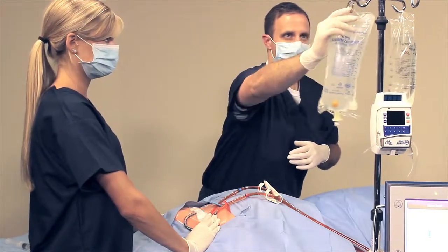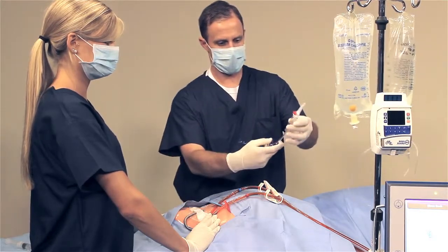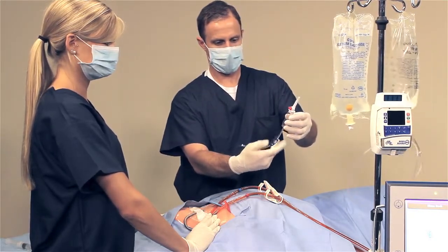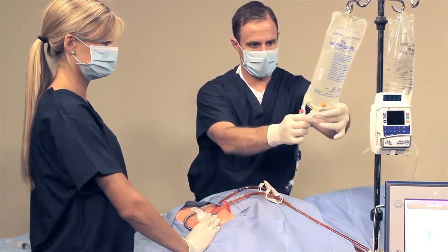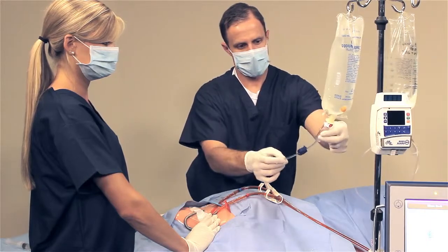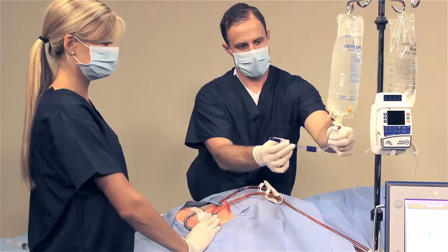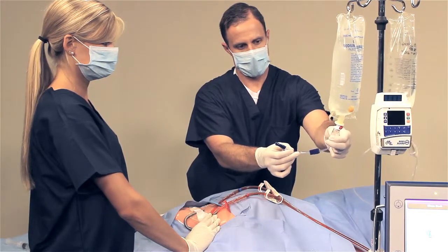Hang the saline bag on the controller. Open the rinse back kit. Close the blue clamp on the IV tubing and spike the saline bag. Fill the drip chamber at least halfway and then prime the IV tubing to remove the air from the line.